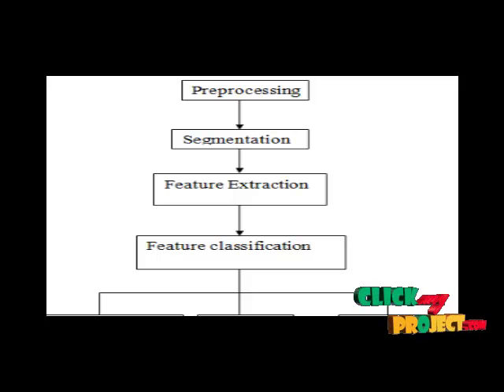We have seen that smoothing filters reduce noise. However, the underlying assumption is that the neighboring pixels represent additional samples of the same values as the reference pixels, that is, they represent the same features at edges. This is clearly not true, and blurring of features results. We have used convolution techniques to implement weighting kernels as the neighborhood functions, which represents a linear process. There are also non-linear neighborhood operations that can be performed for the purpose of noise reduction that can do a better job of preserving edges than simple smoothing filters.